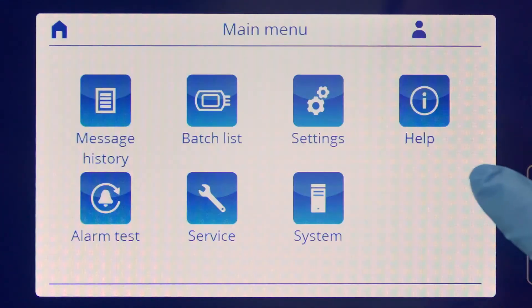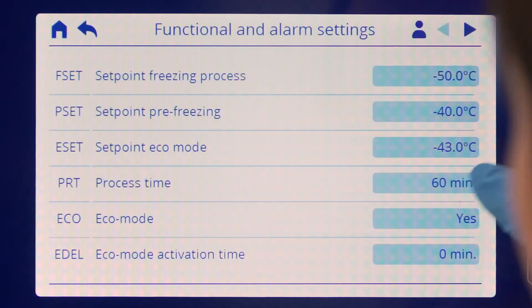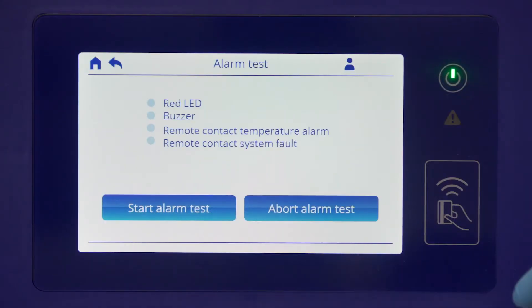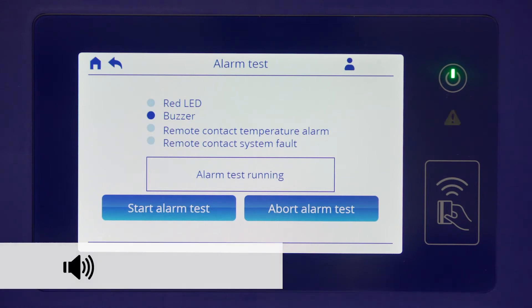The parameters preset at the factory can be adapted to your needs. It is recommended to run an alarm test to make sure that you will be alerted of any unexpected issues risky for your bags during the process.